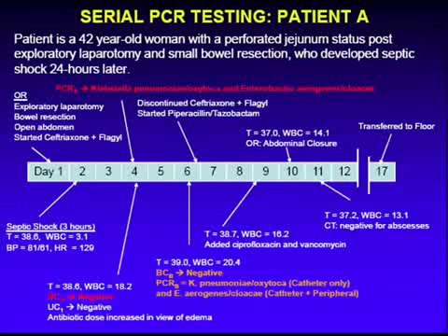Here we can hypothesize that serial PCR testing can detect pathogens which blood culture missed, potentially due to 1, altered pathogen distributions during septic shock, 2, antimicrobial therapy inhibiting blood culture results.